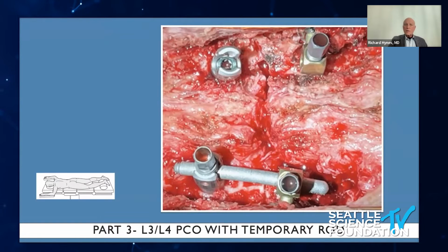And I think it's just so critical to focus on, take a minute and put on a temporary rod. This is an extremely unstable procedure, which is the value. You can get great correction, you can get a great complication. And I think we've all learned from even the prone lateral that in the prone position, the advantage is you can get a nice lordosis without having to do this, or if you need it, you can do it. But you can also get iatrogenic release of ALL without desirability and maybe too much correction. So put that temporary rod on when you're doing this.